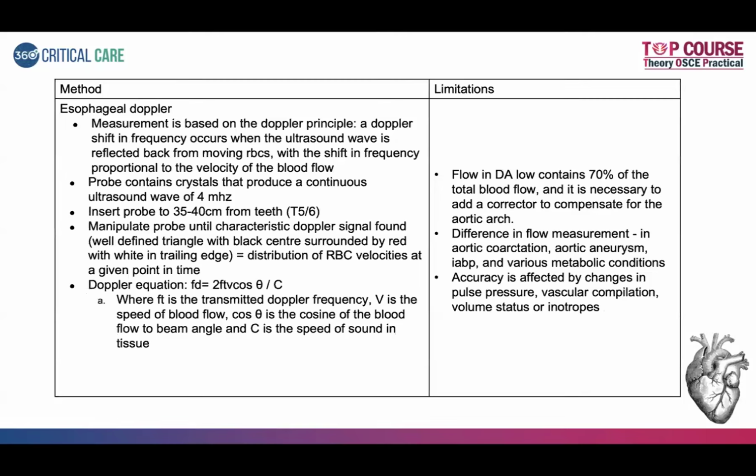As I already told you, this esophageal Doppler is nothing but doing a TEE and seeing the flow in the descending aorta, right? There is an ultrasonic wave which is going to sense the blood flow in the descending aorta, and it is going to give us the cardiac output. So it is based on the Doppler principle. What is the Doppler principle? A Doppler shift in the frequency occurs when the ultrasound wave is reflected back from the moving RBCs, with the shift in frequency proportional to the velocity of the blood flow.